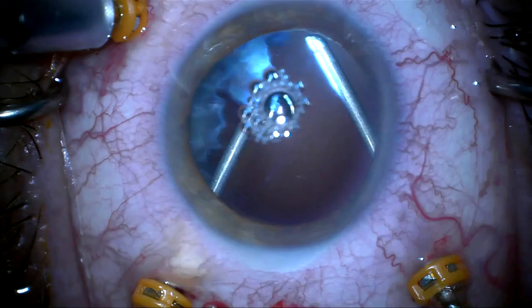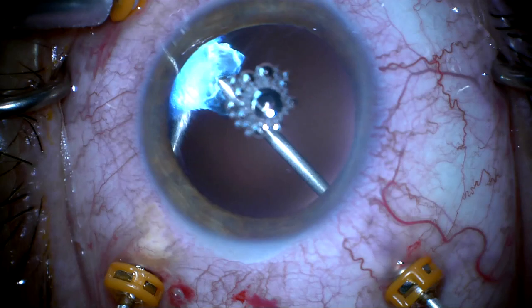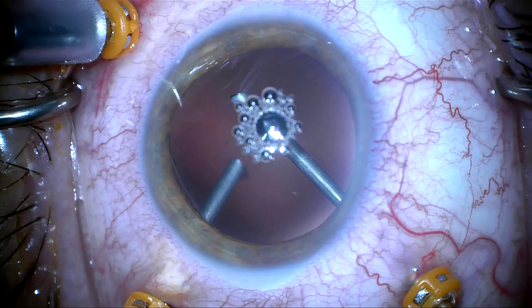Mostly I'm successful. At the very end, returning to about normal speed, you can see a couple of pieces do fall back as I finish my vitrectomy of the lens. I'll now do a little bit more cleanup anteriorly, remove these air bubbles, and then go back and complete the vitrectomy to remove fragments that have fallen back using the posterior illumination system.